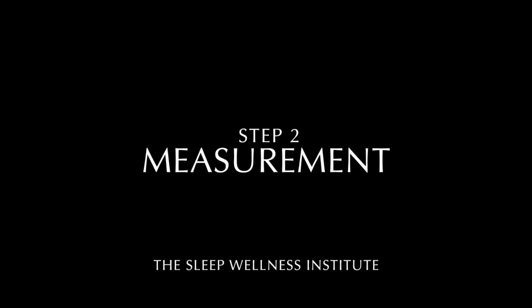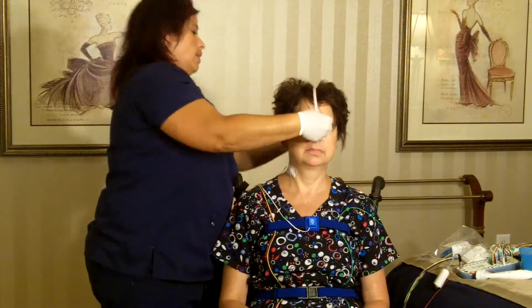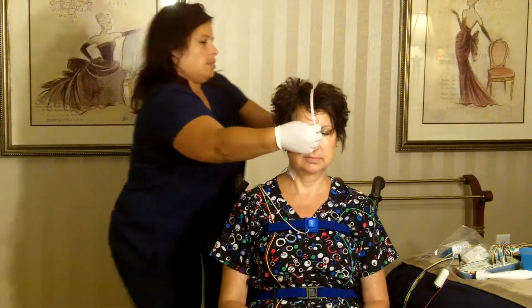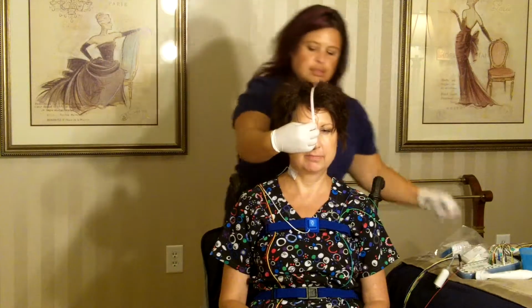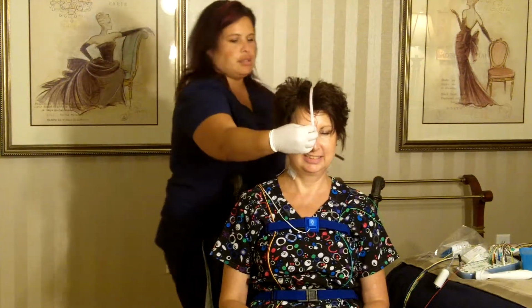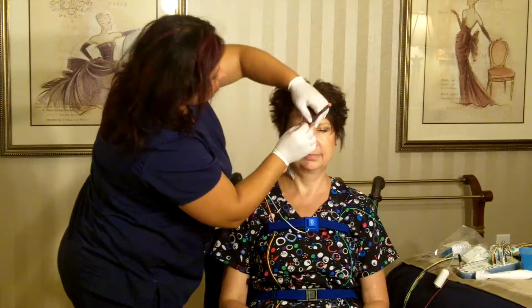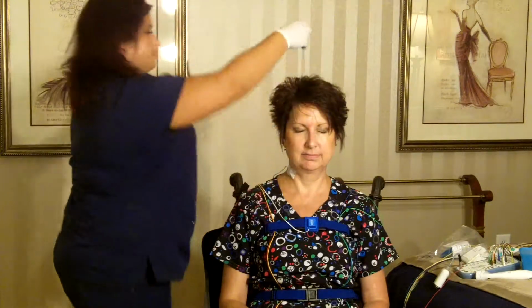Step 2. Using a tape measure and a washable China marker, Mindy is measuring the top of Kayla's head. This is because each electrode needs a precise placement to measure different areas of the brain that produce different types of brain waves. While Mindy finishes measuring, here are some do's and don'ts for your sleep study.